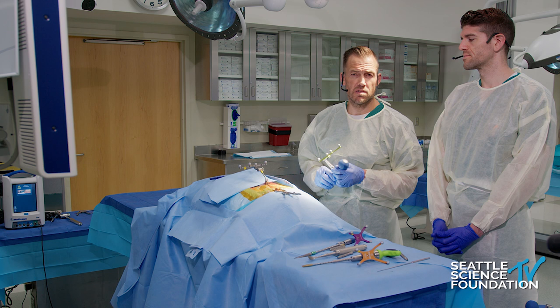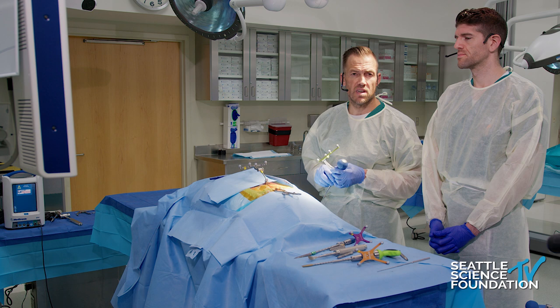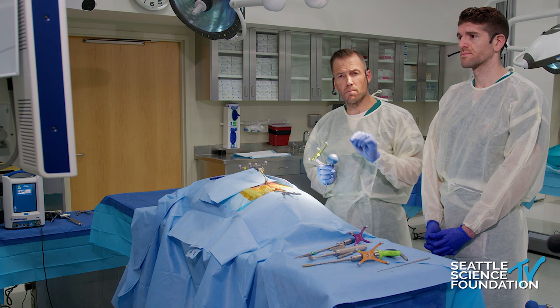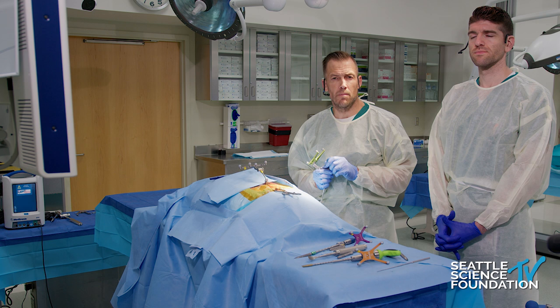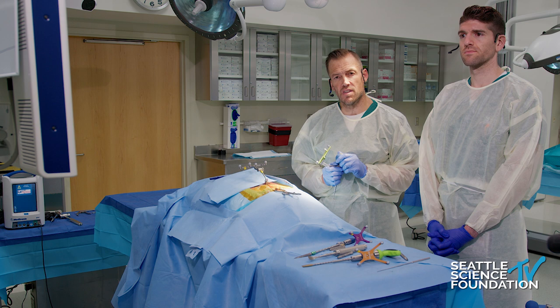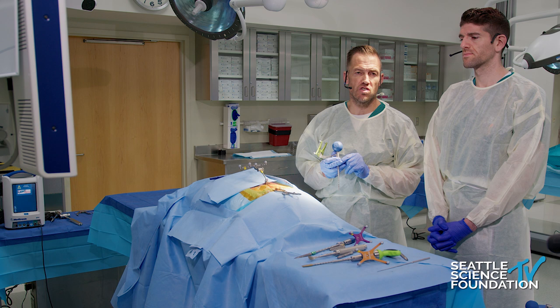It's important to take reference array placement into account with surgical planning from the get-go. If doing a standard open scoliosis reconstruction, you can add your reference array to the spinous process through the open wound and utilize navigation to deliver the safest trajectory. My starting point for an S2 alar iliac screw is taking advantage of the sacral ala between the S1 and S2 neural foramen. With fluoroscopy, I use an outlet view of the sacrum and place my gear shift right between those foramina.